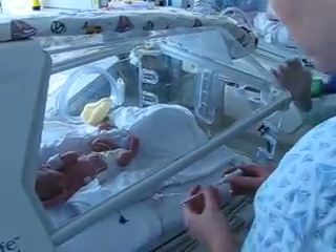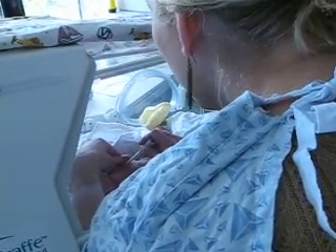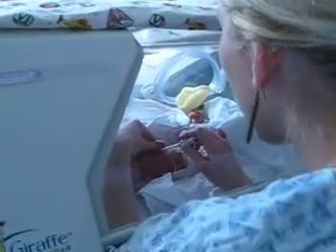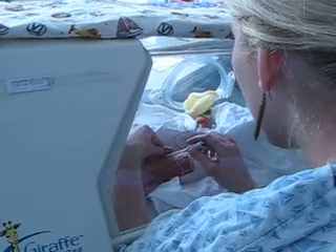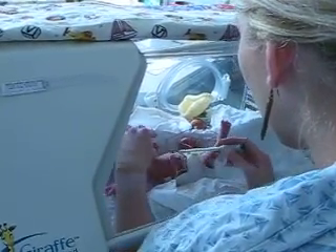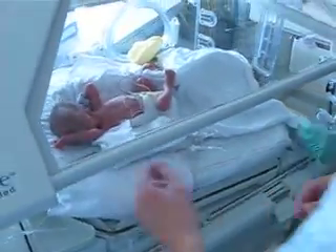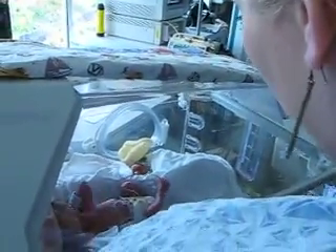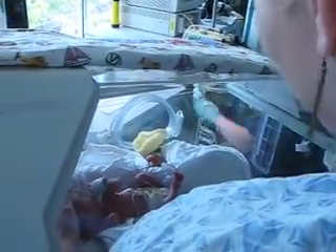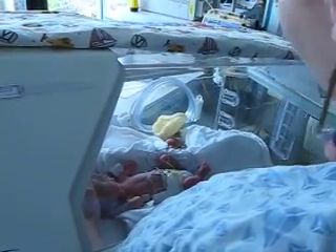Just put that probe in an armpit, right in the middle, and close his arm. Fine, 36.6. And that's how you'll take his temperature at home too, when you think he's ill. Under the arms — called axillary. No rectal temps, because they're always moving their legs, and it's really easy for that thermometer to go up way farther than it needs to.